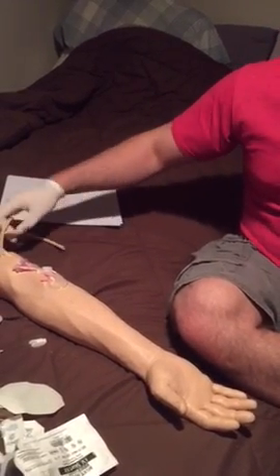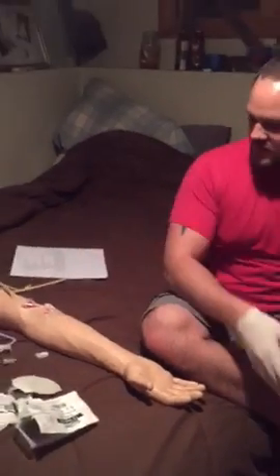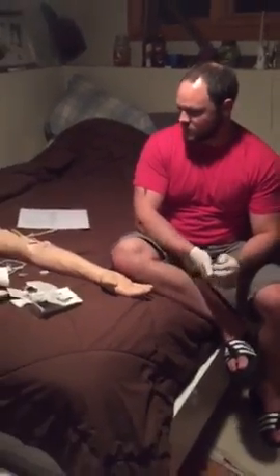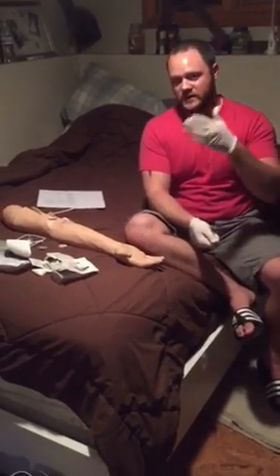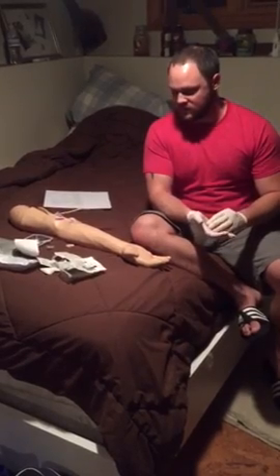So after that, our patient's all good. We have a good patent IV line. We would document it, do our run report to the hospital en route, and tell them that we have a 20 gauge IV in the right AC.